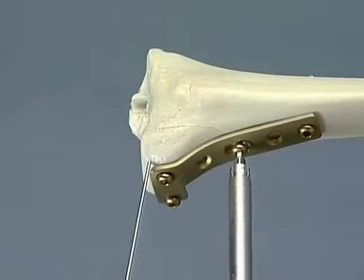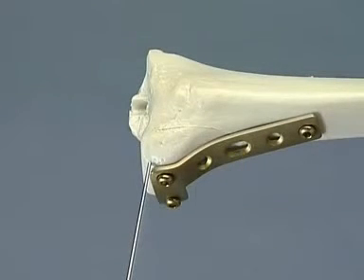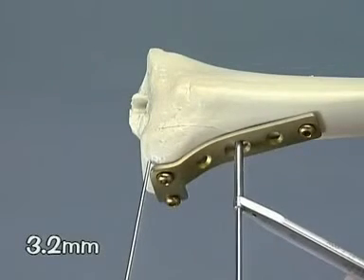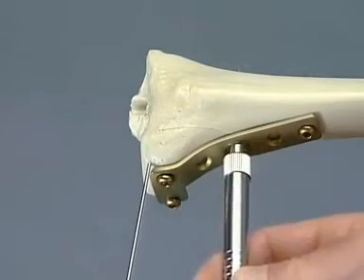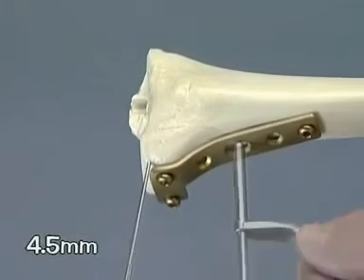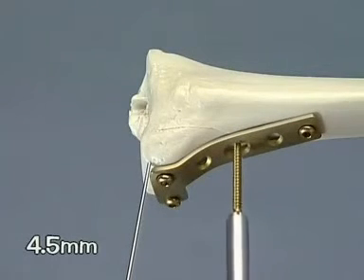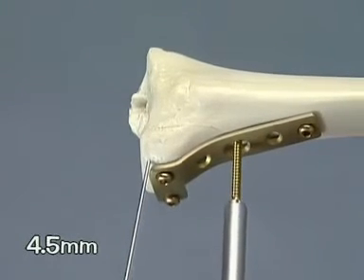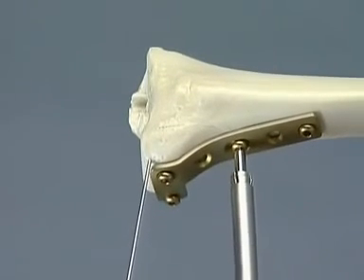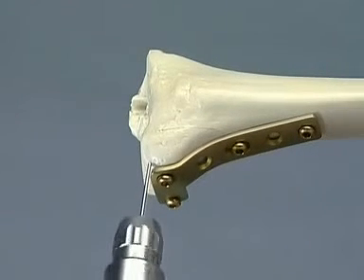Remove the 16 mm screw and drill the hole through the opposite cortex with the 3.2 mm drill bit. Measure the depth. Tap. And insert a cortex screw. Remove the K-wire.